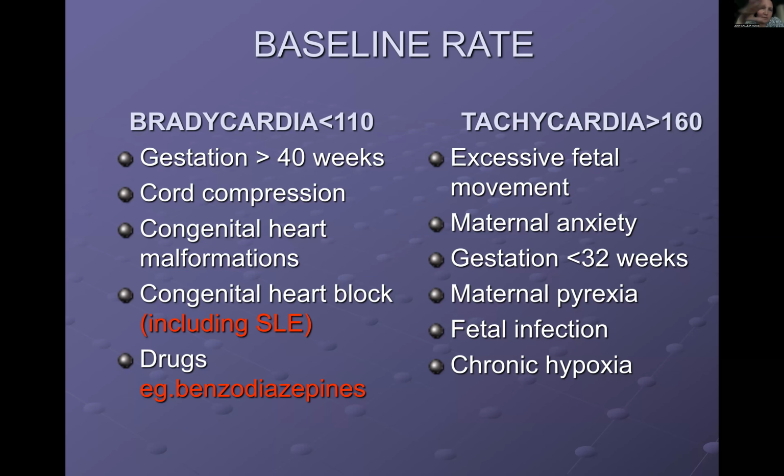What this means is you need to take the history of the patient and look at the notes. If she's post-date, if she has a history of SLE, if she's on certain medications, then in that case you know there is a baseline bradycardia. But of course, if there are none of these, it could signify cord compression.